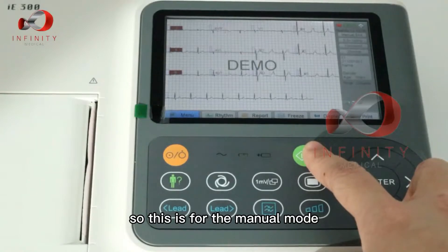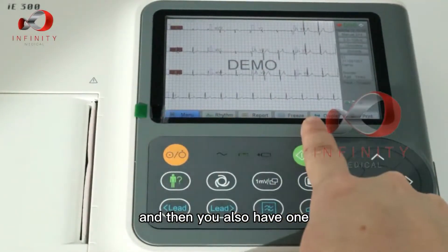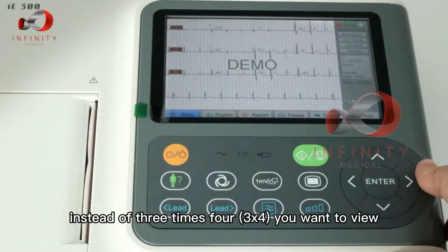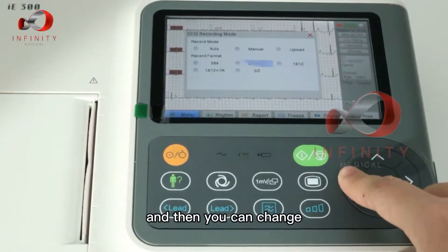In manual mode, the format is similarly three times four for the viewing format with one rhythm lead. If you want to view other settings instead of three times four, press here and you can change the format.